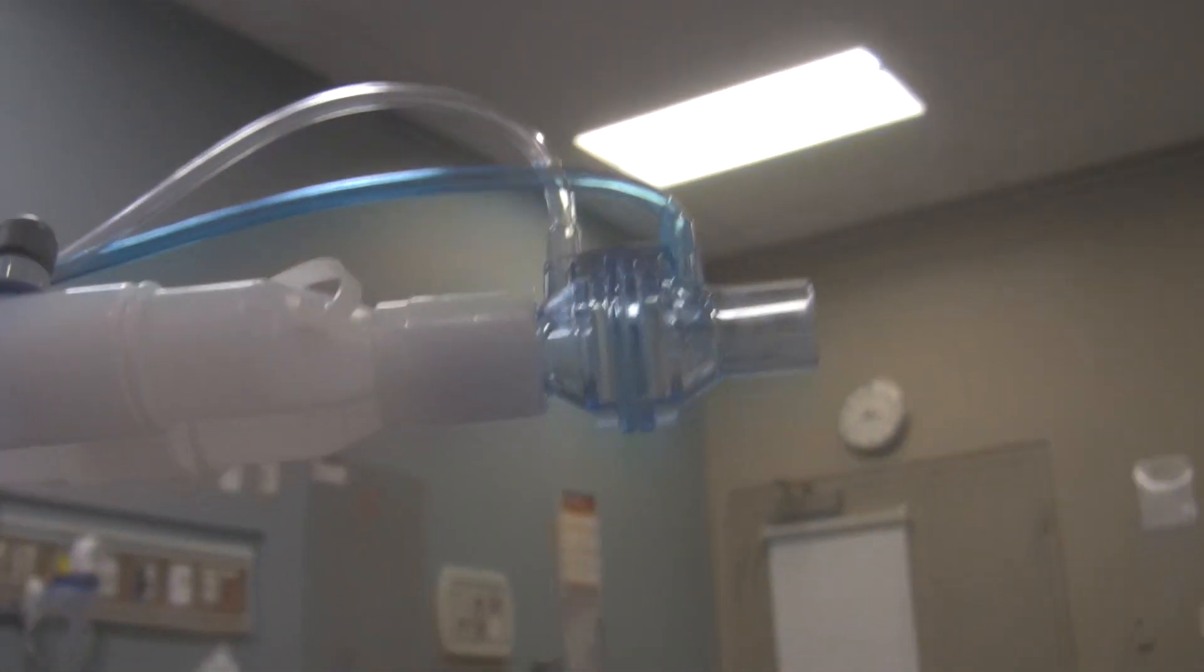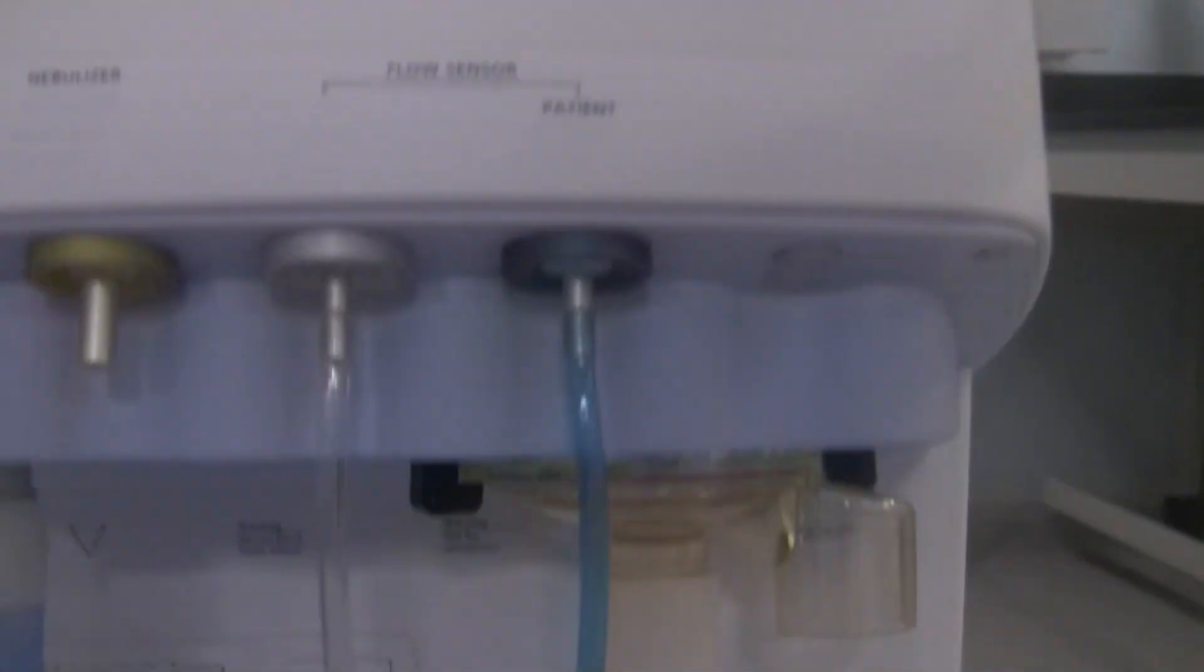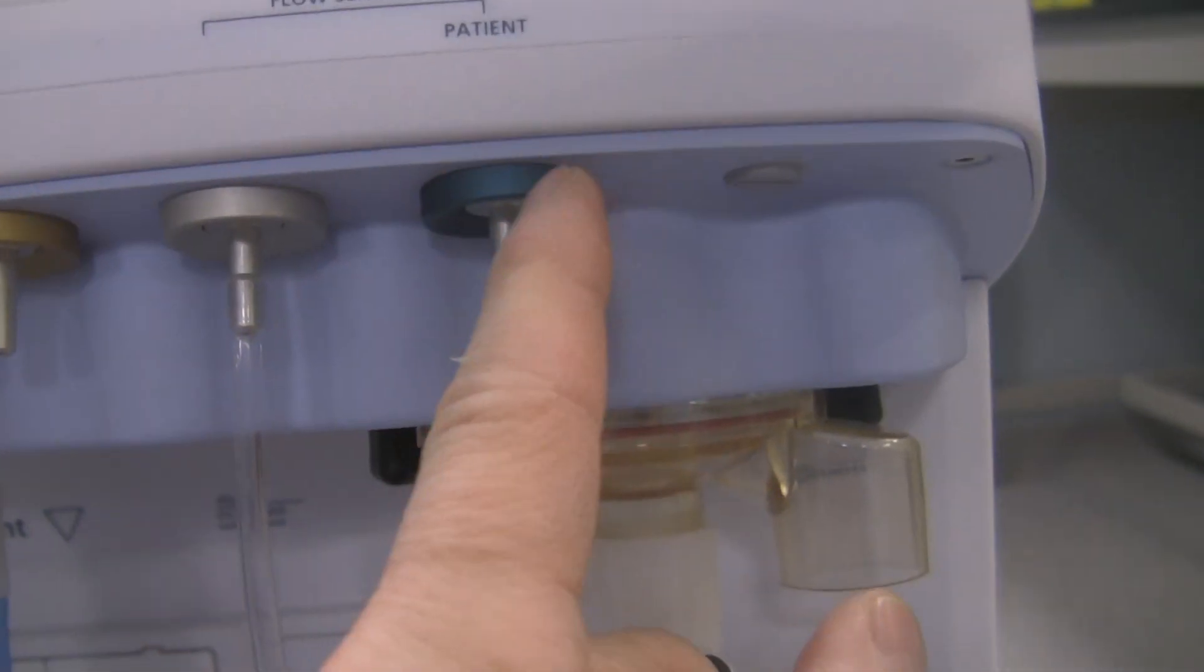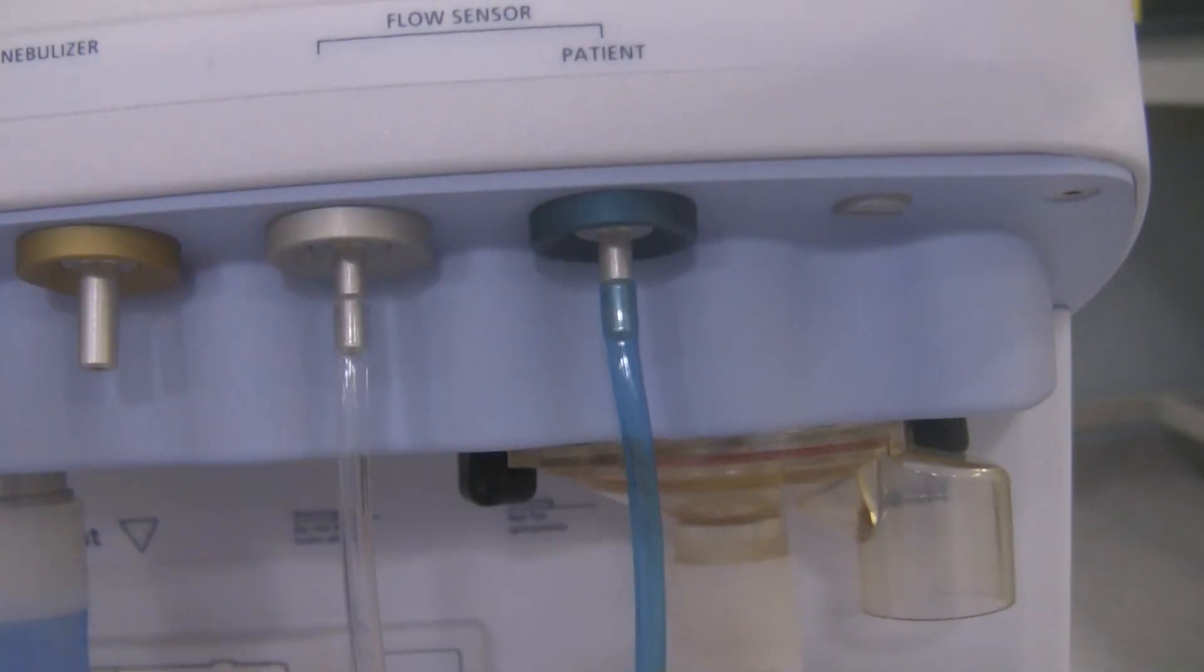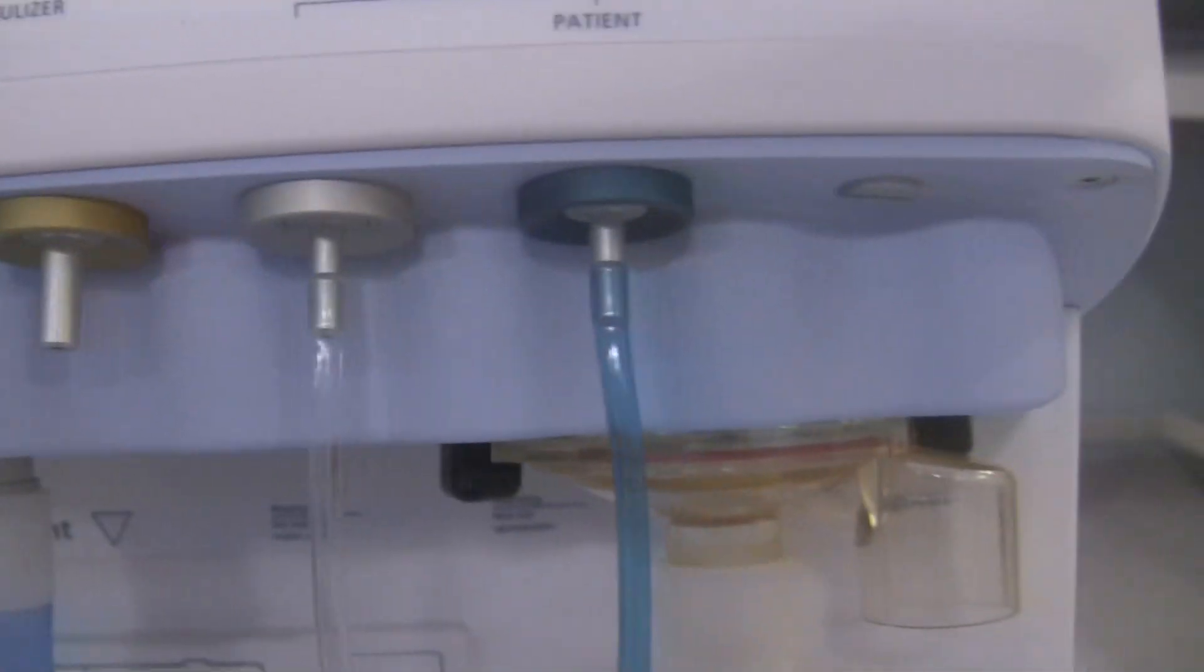The flow sensor is this device right over here that you'll see hooked onto the patient. It consists of a blue tubing and a clear tubing. The blue tubing of that flow sensor will travel all the way back here to the ventilator and you make sure the blue tubing is hooked up to the blue color-coded port and the clear tubing is hooked up to the silver port which is meant to mimic or represent clear.